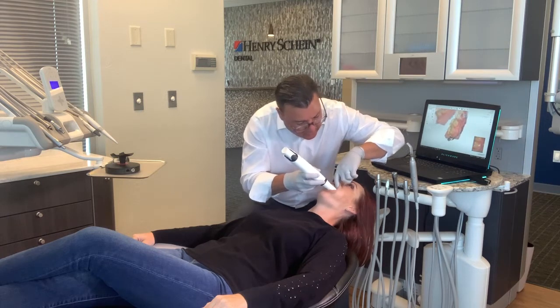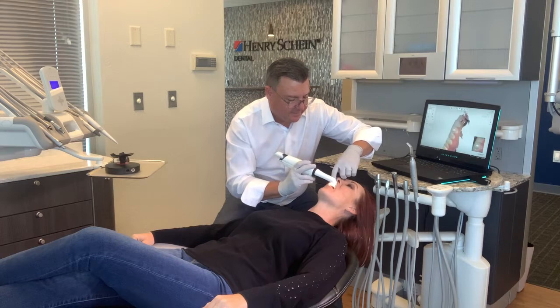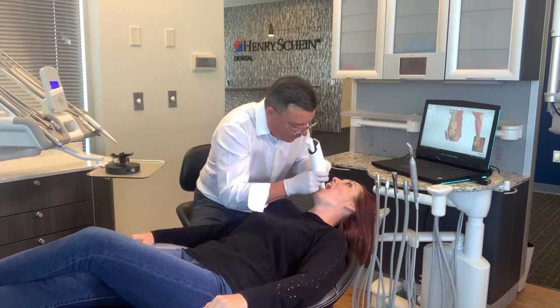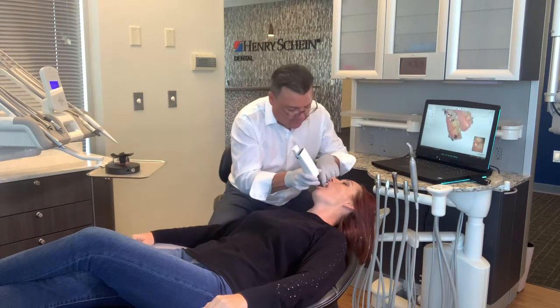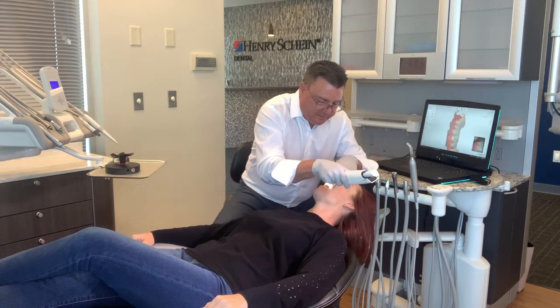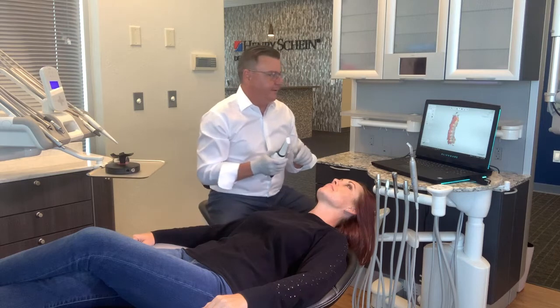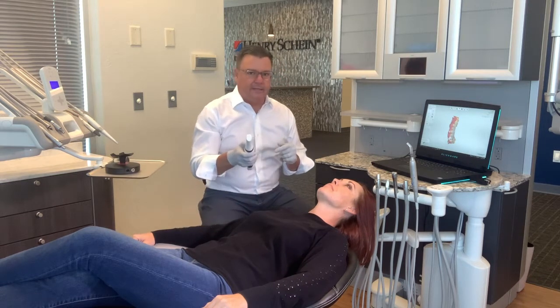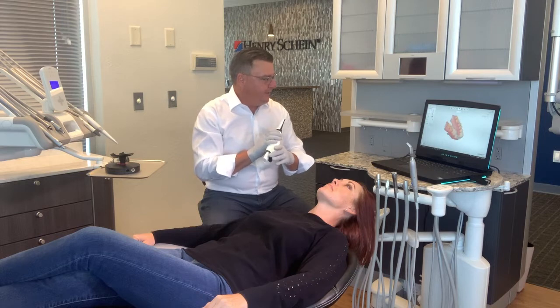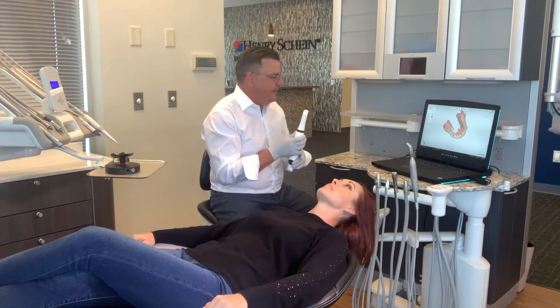You'll notice I'm taking a fourth pass with the scanner. I know there are a lot of people who scan faster than I do, but one of the things I try to do is make sure that it's complete when I'm all done. So I take a little bit more time to make sure I don't have to go back in unless it's necessary. I'm going to click up and we're going to take a look and see if I'm missing any data anywhere. It looks like the lingual side is pretty good.